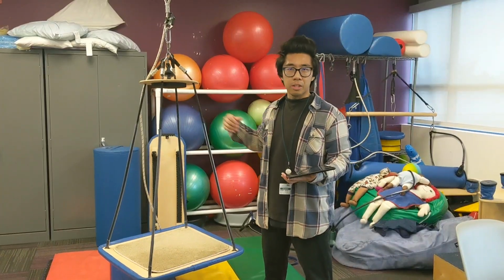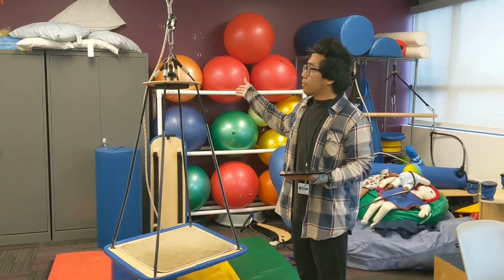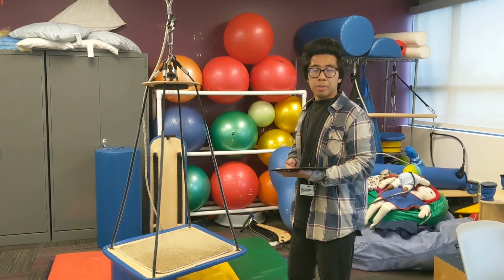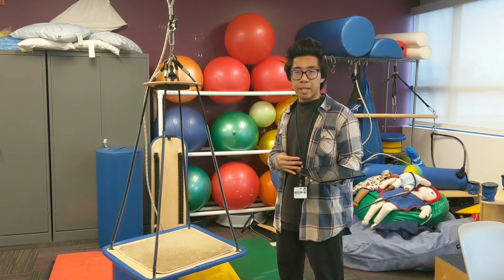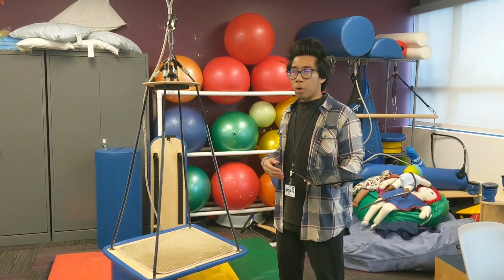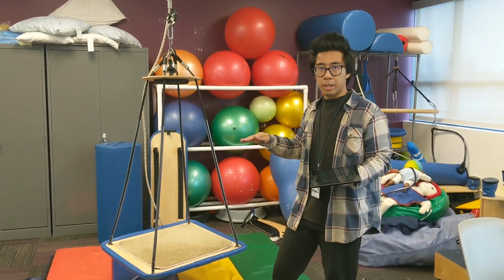Before we get started, I just wanted to talk about the precautions and contraindications when using vestibular equipment. First and foremost, if a child has a seizure disorder that is not controlled by medications, and seizures are elicited by vestibular input, then equipment is contraindicated.